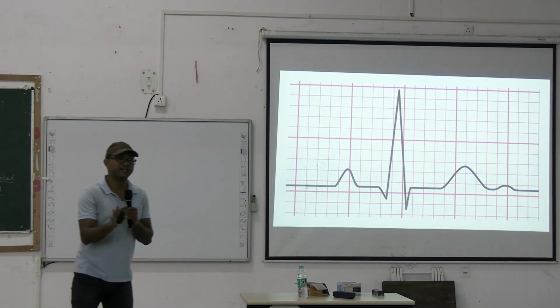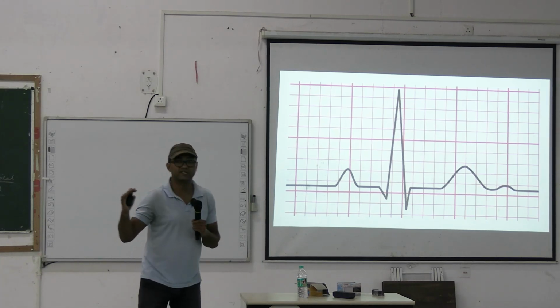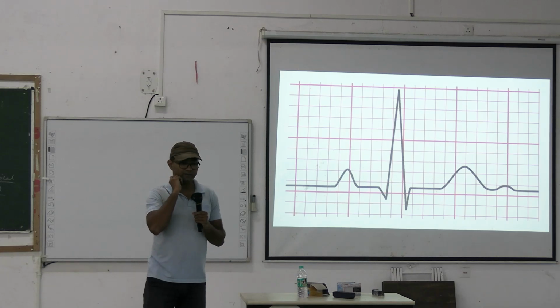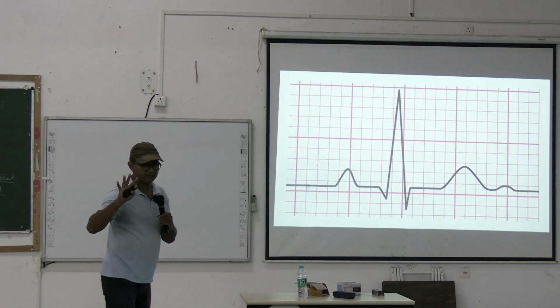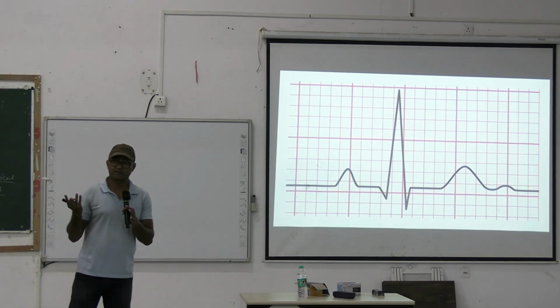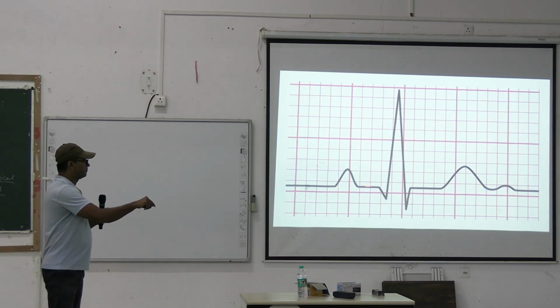During this time, there is no net flow of electricity, right? Okay. তার মানে এই ডিউরেশনটাতে কোনো ইলেকট্রিসিটি ফ্লো হচ্ছে না অ্যাপারেন্টলি, অর হচ্ছে একটাকে ক্যান্সেল করে দিচ্ছে, রাইট? ওকে, সো নো নেট ফ্লো অফ ইলেকট্রিসিটি ডিউরিং দিস টাইম.